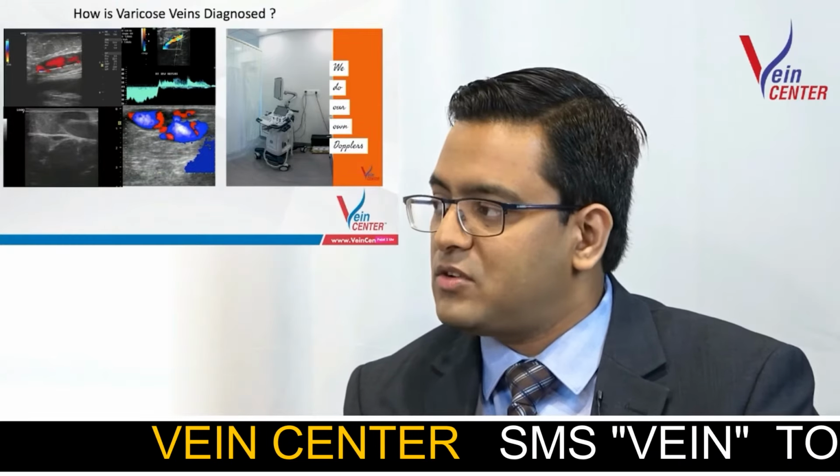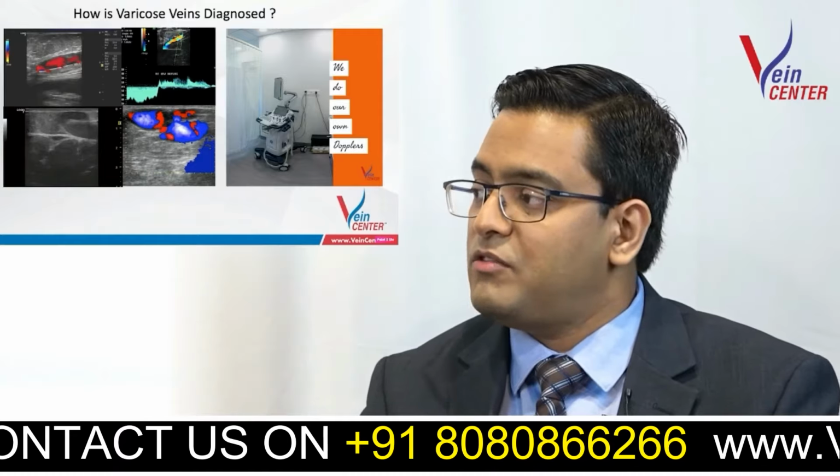Now, other than that, a color Doppler examination also helps us look for other diseases of the veins. This can be deep vein thrombosis, which is clotting in the veins, a superficial venous thrombosis, which is again clotting in the superficial venous system, inflammation of the veins called thrombophlebitis, or even a condition called deep venous reflux, which is the non-functioning of valves in the deep venous system. Whether the patient has this or not, or whether there are any clots or not, has an implication on how we treat the patient. Other than varicose veins, we have to treat the patient holistically. So if you have something else, we can then tailor the treatment accordingly. I like that, treating holistically.